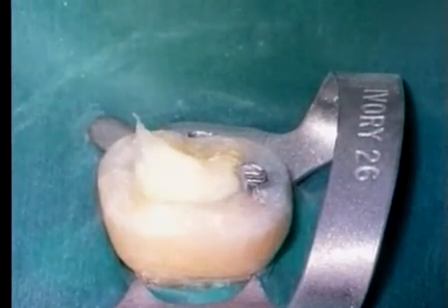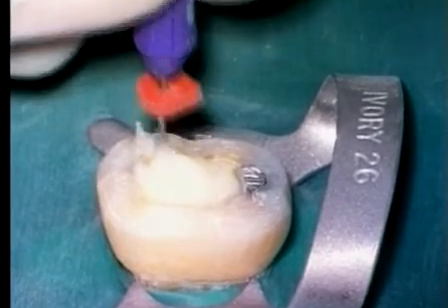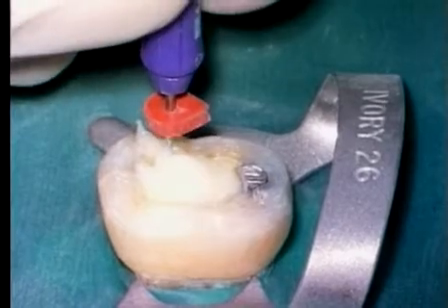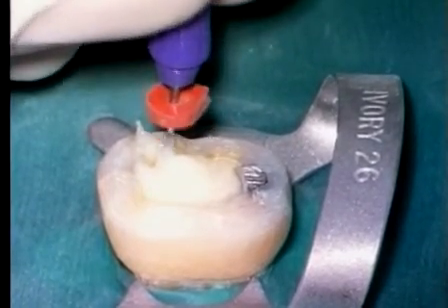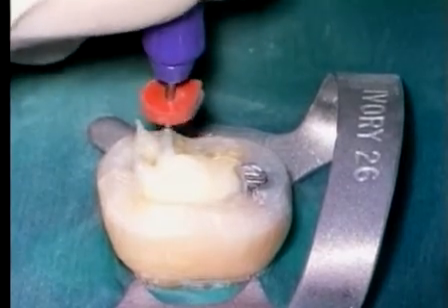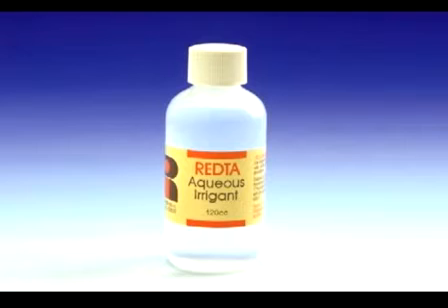The lubricant encourages the file to slip and slide by intracanal calcifications such as pulp stones or sheaths of fibrotic tissue. A viscous suspension of a chelator advantageously promotes the emulsification of vital tissue and facilitates the negotiation of a canal. Research has shown that a 1-minute rinse with EDTA eliminates the smear layer, opens up the dentinal tubules, and provides a cleaner surface against which obturation materials may adapt.